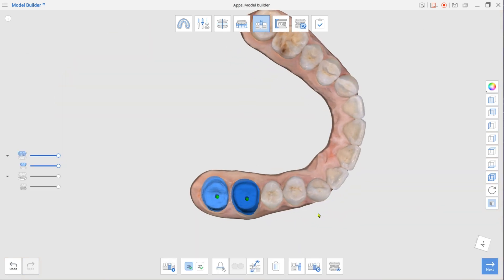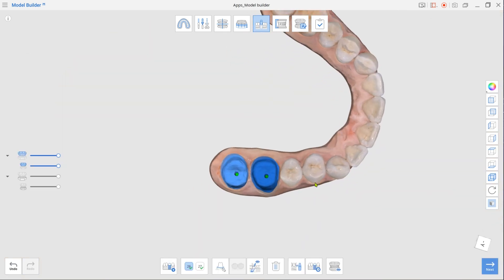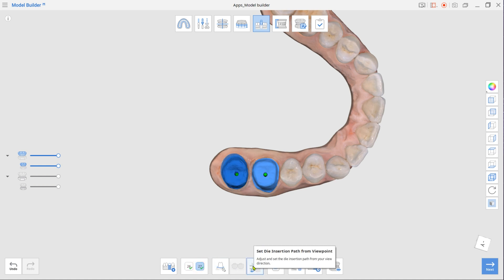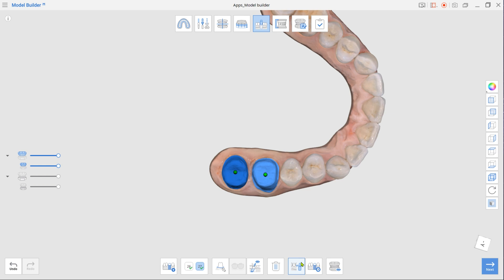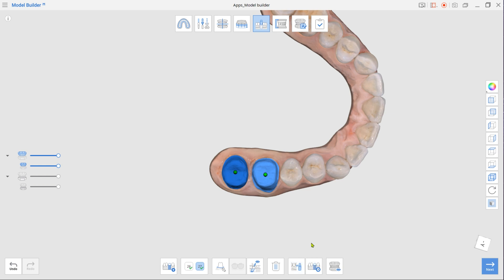Rotate the model so that your view direction would match the die insertion path and click Set Die Insertion Path from Viewpoint. Repeat this process for each die. To create additional dies, make sure the Extra Dies option is selected in the toolbox.